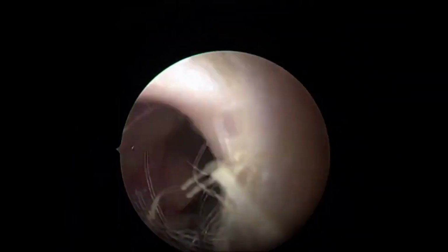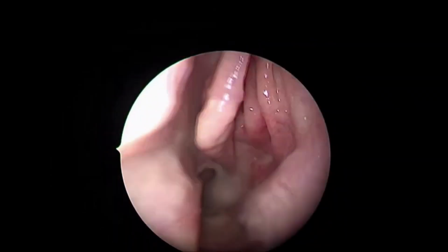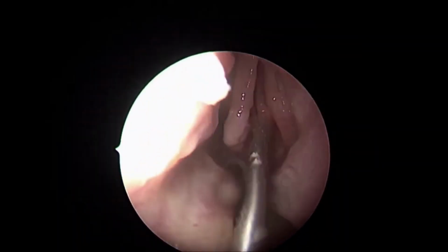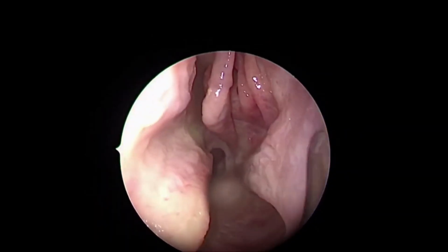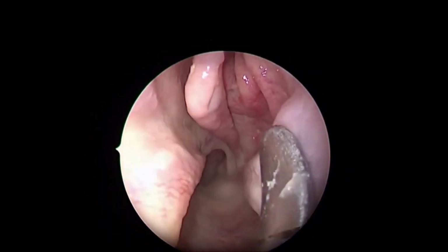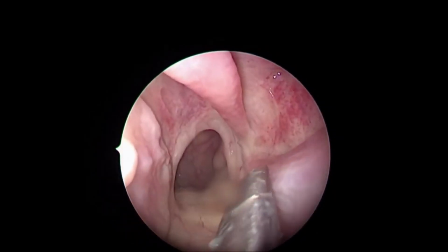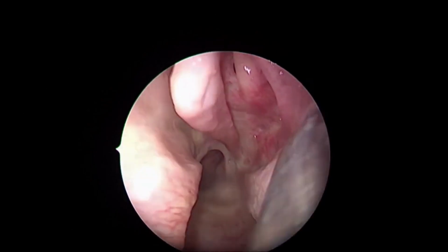So these are the turbinates, which are prominences or protuberances in the lateral wall, which lead to certain recesses underneath them. This is the inferior turbinate. We'll discuss later in detail how important this is to us. It is covered by a special tissue which is important in regulating the airflow and mediating certain reflexes.